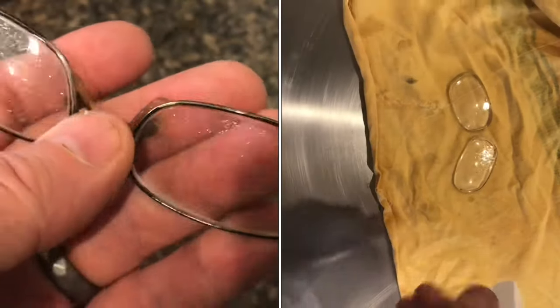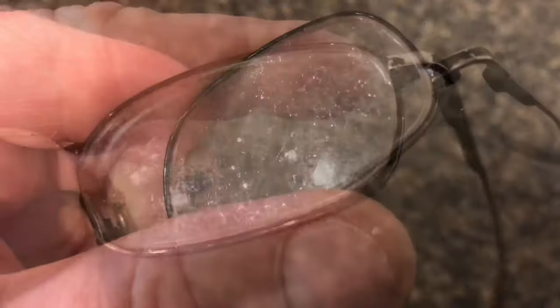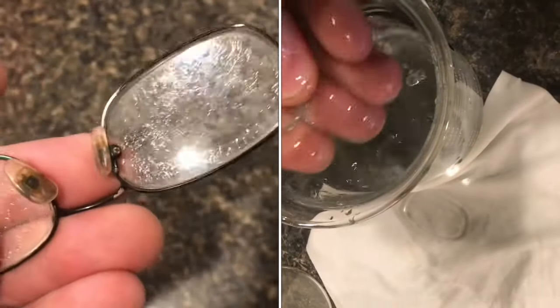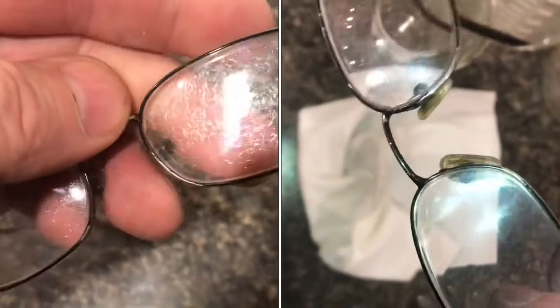The coating on these glasses has completely ruined these lenses. I'm going to show you how I'm going to fix this problem. If these are glasses that you rely upon, take them to a professional. You want to practice on a pair of glasses that you're willing to throw away. It takes practice to restore lenses back to their original shape.